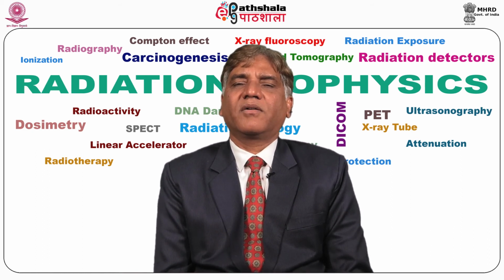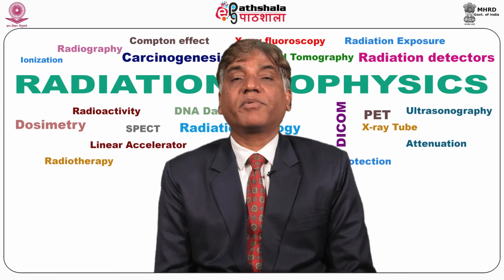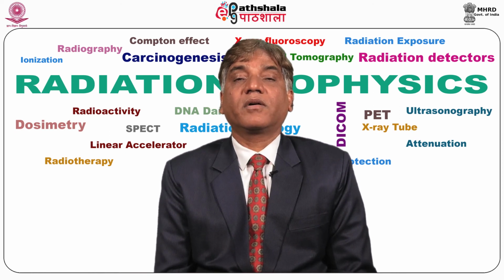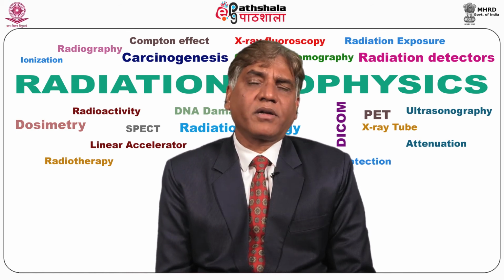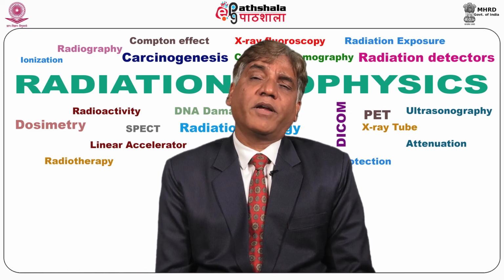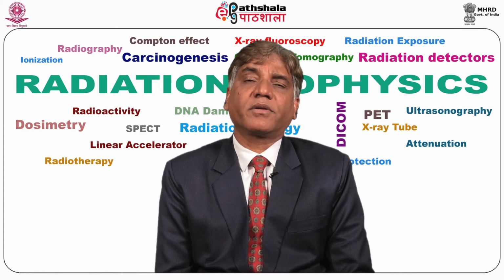There are 5 techniques in blood flow imaging. One is the continuous wave Doppler, we have the pulse wave Doppler, we have the duplex Doppler, we have the duplex color flow imaging Doppler, CFI color flow imaging, and the power Doppler.